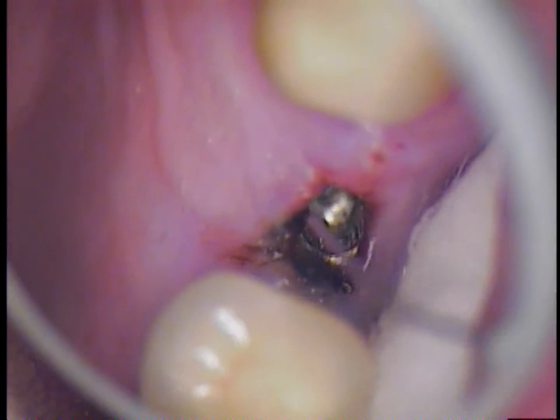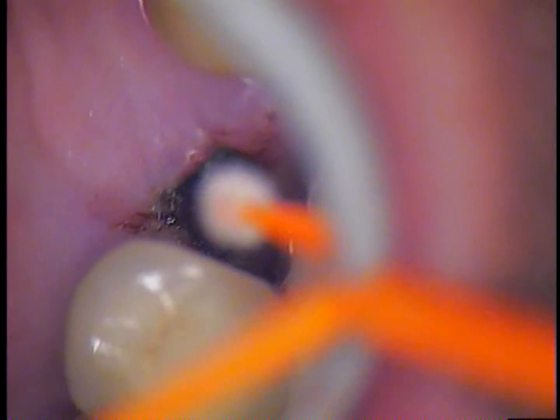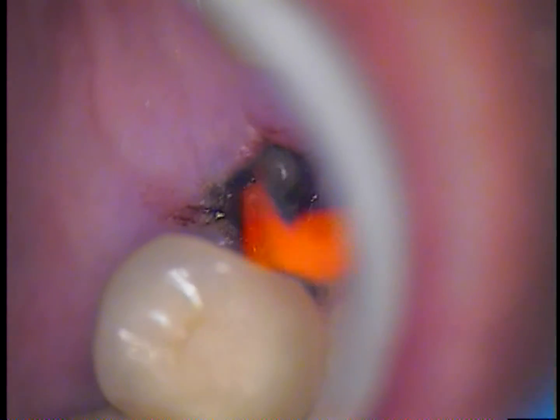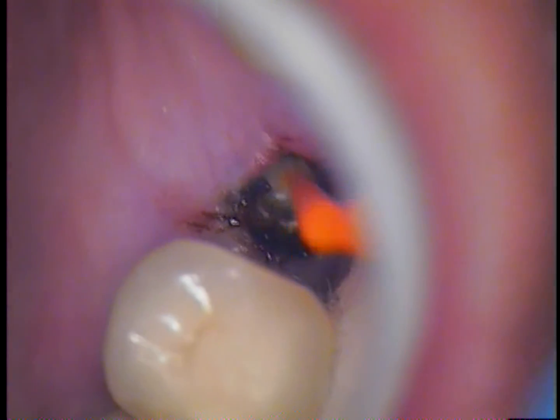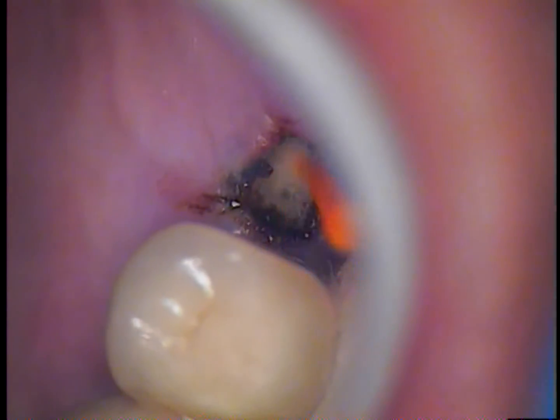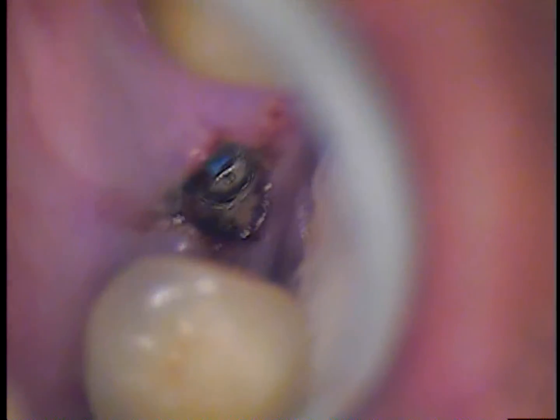If you go to the websites, you can check on all the specs on the abutment, where it has a lot of stability built into it. That 30-degree rotational capability allows for certainly improved aesthetics. With this case, you also have that deep four-millimeter internal engagement, which helps as well. Most companies are understanding that a lot of the stability comes with the abutment and how long it goes down to cover the actual screw.